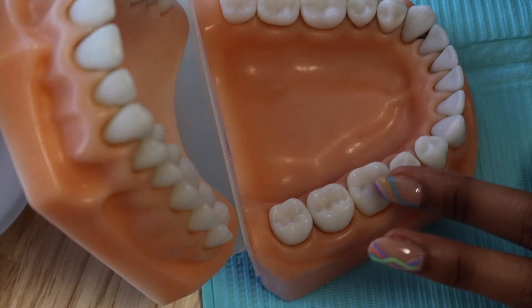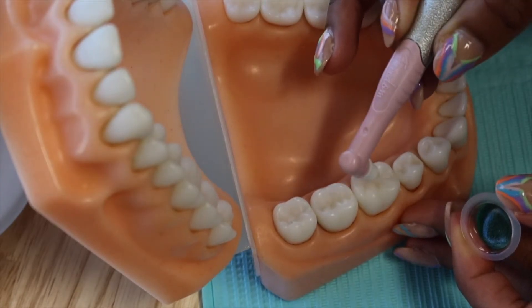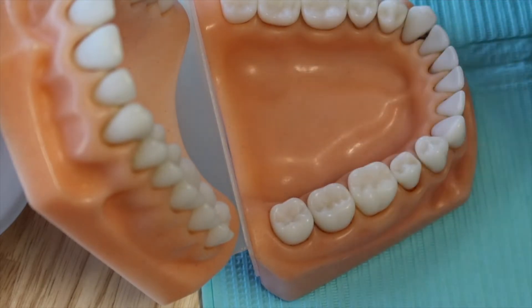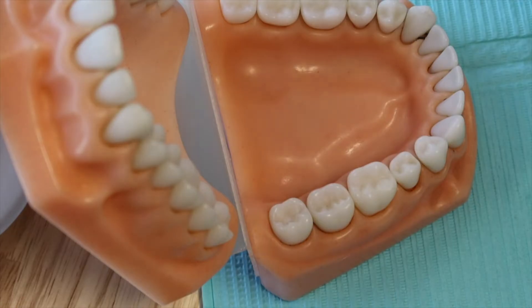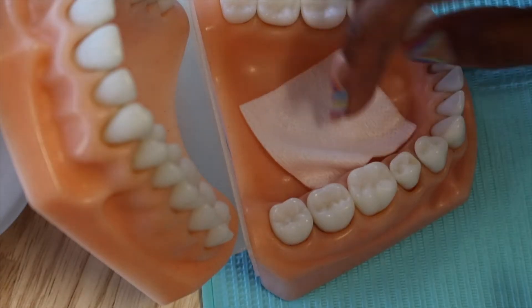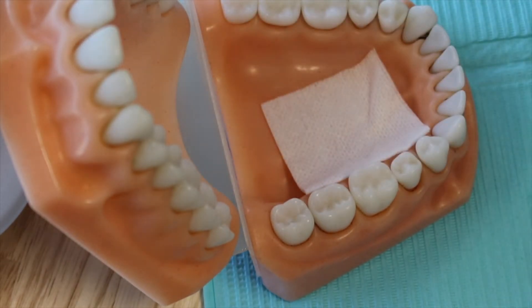Beginning in a controlled environment, I usually start by polishing the occlusal surfaces — since there's no debris on the typodont I'll just demonstrate the motion, but I'll actually do it in the mouth in a second. Next you want to dry the tooth. You'll clean it and dry it. At this point in the mouth I'd place something to control the environment — the tongue would be there along with a lot of liquid — so I'll place that isolation now and act like there's some liquid.